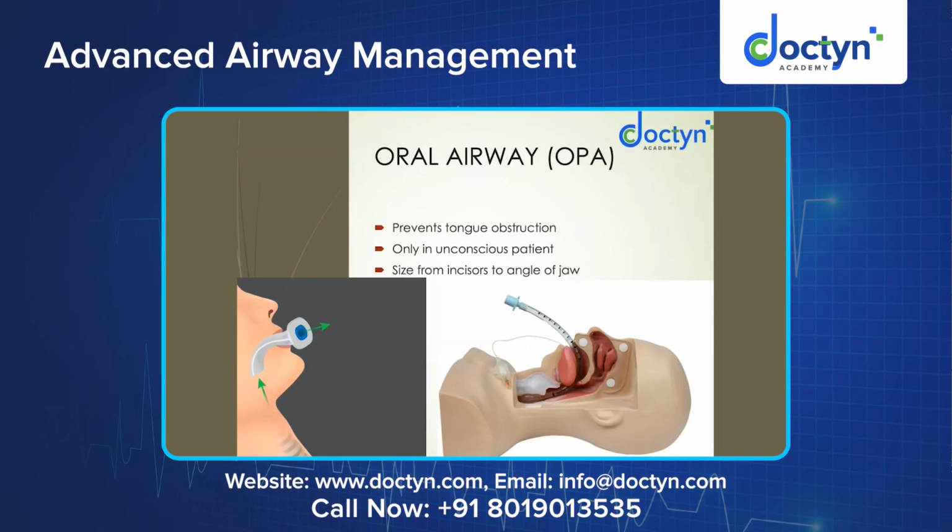So now we have a patient who has a cervical spine injury, so we cannot do head tilt and chin lift. We can do a jaw thrust, but it is not effective. Even with a jaw thrust, the saturation is not improving. We are not able to maintain ventilation. Whatever ventilation we are giving through the AMBU is not passing through the oral cavity and the vocal cords and reaching the lungs. So what do we do in those patients?